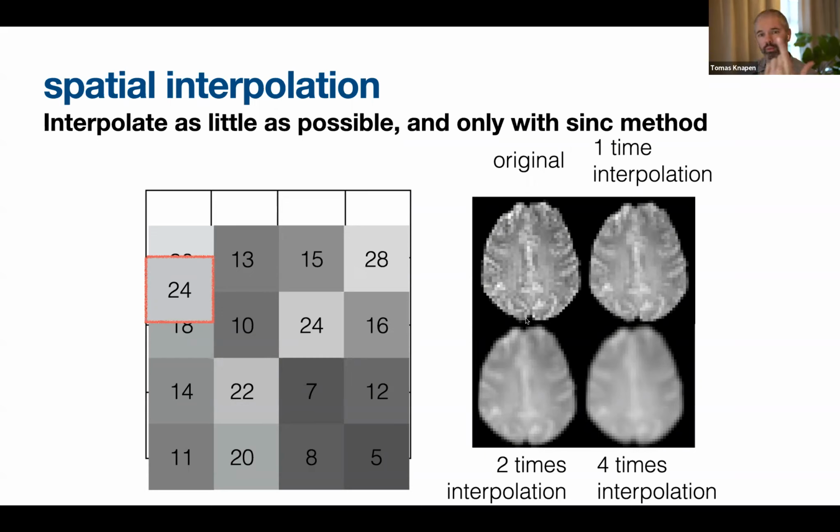and then you're going to do motion correction, you're going to do unwarping, and then you're going to co-register everything to your average subject, for example, right? I'll be talking about that in a bit, but what that means is you're going to do 3 interpolations, 3 transformations. And if you do 3, you're going to end up having smoothed your data incredibly.